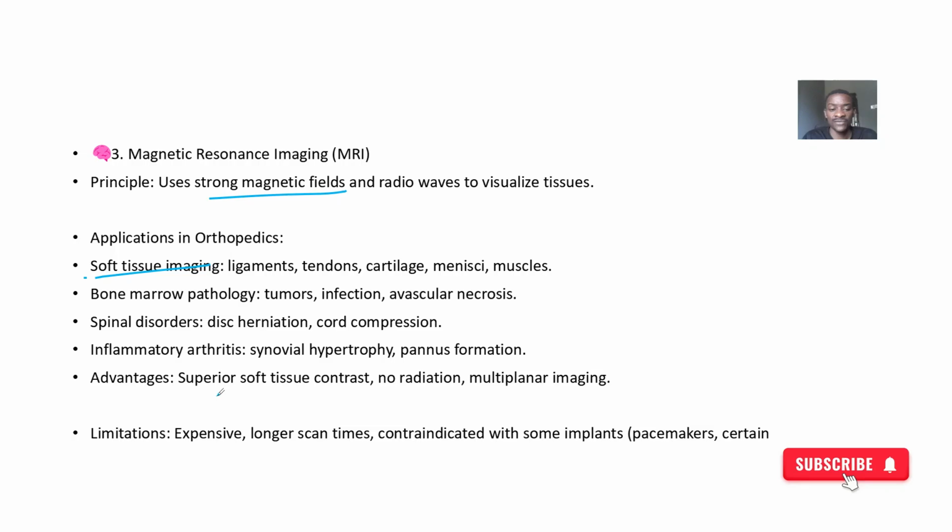So advantages, it gives you a superior type of image, very clear image than the other ones. And there is no radiation here, so the patient doesn't stand those chances of side effects and exposure to radiation.